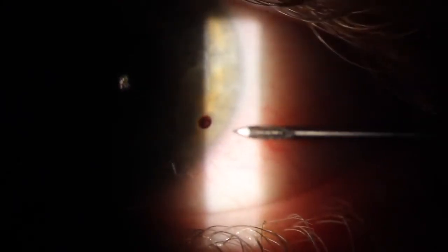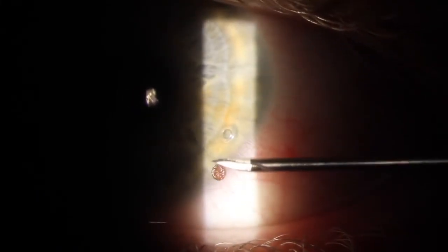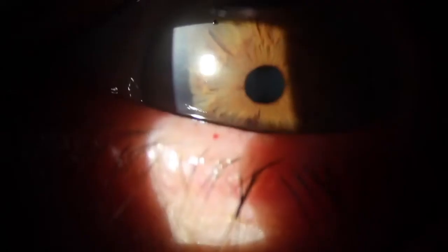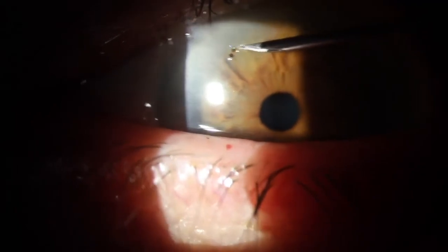As you can see here, there's a peripheral corneal foreign body that's quite metallic in nature. I'm using the needle and keeping it parallel to the eye to easily remove that little foreign body, which had been in for a couple of days and so had rusted into the eye. A lot of these foreign bodies are sharp metal objects.